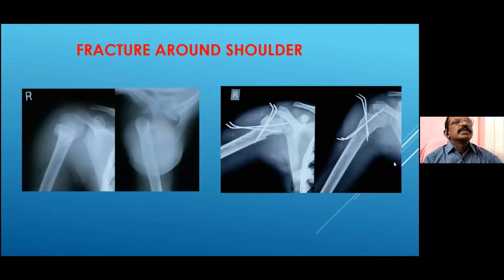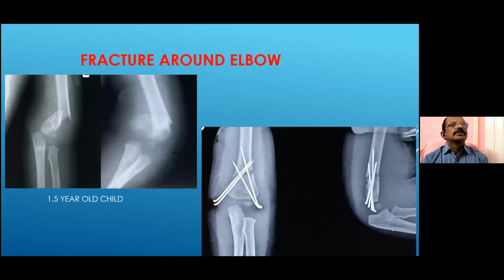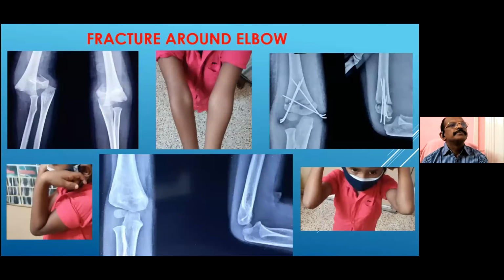This is the fracture around the shoulder. This is a closed reduction and percutaneous pinning for the proximal humerus. This is a fracture around the elbow. This is a 77-year-old lady. The closed reduction and percutaneous pinning for supracondylar, intercondylar fracture. Then fracture around the elbow. This is a 1.5-year-old child. The proximal third humerus, distal third humerus, done by closed reduction and percutaneous pinning.